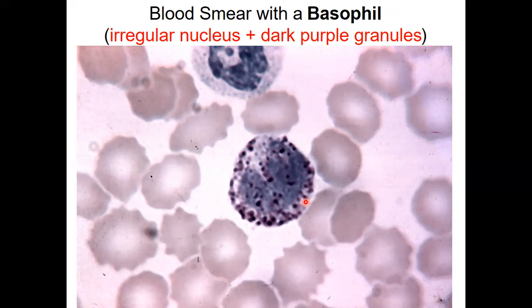So that's why it's given the name basophil, because it picks up much of the basic dye. So it will stain bluish or purplish. Neutrophil, it was picking both eosinophil and basophil stain.